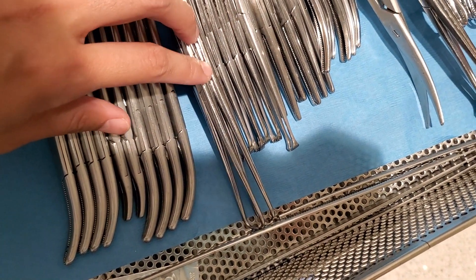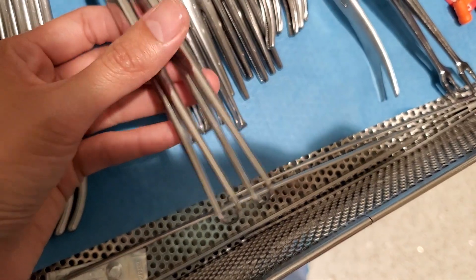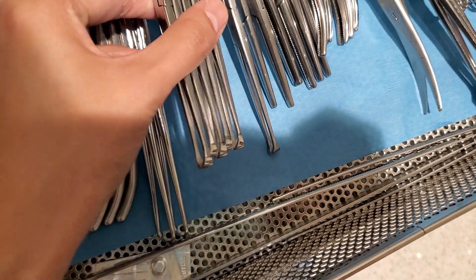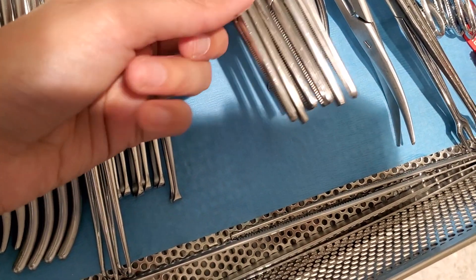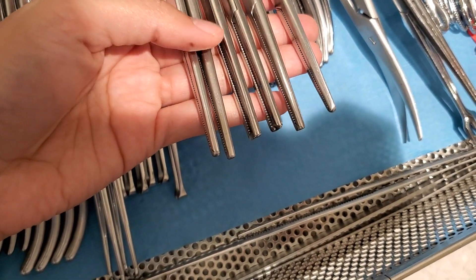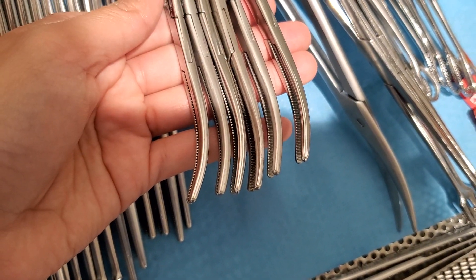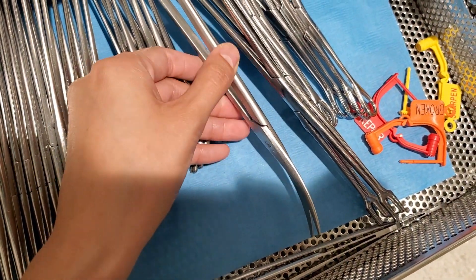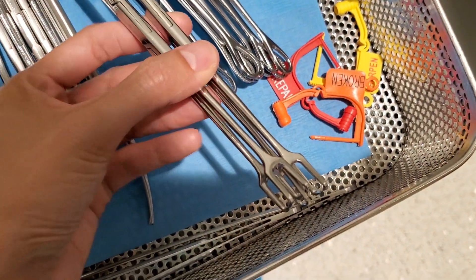These are just lost-in-the-middle single tenaculums — these are sharp. Your regular Allis clamps. These are a lot of Kochers — these are all Kochers. These are your Kellys. Long scissors, curved. And these are also tenaculums.